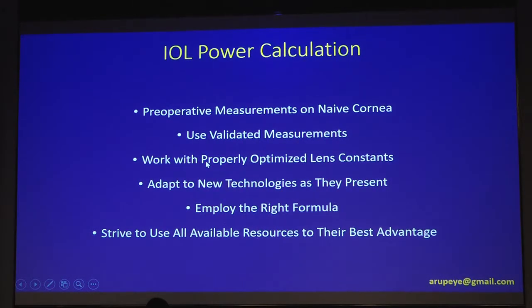So friends, in conclusion, what I would like to tell you is that I would like to take measurements on a pristine cornea. Measurements should be validated, work with properly optimized lens constants, adapt to new technologies as they present, but remember that any new technology may not give you very significant advantages. Employ the right formula and strive to use all available resources to their best advantage.